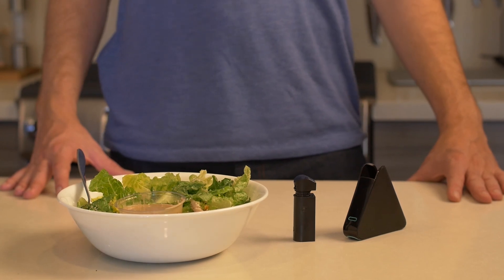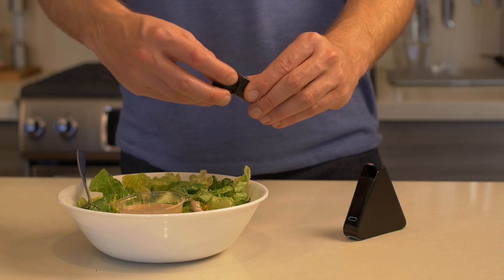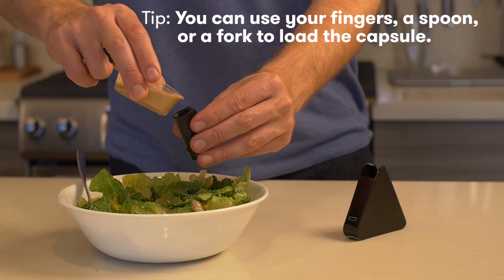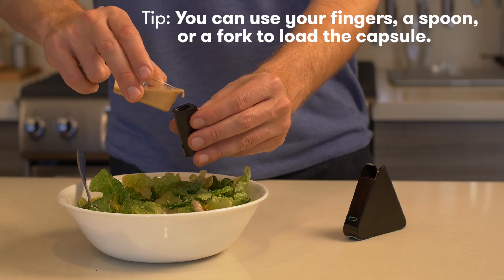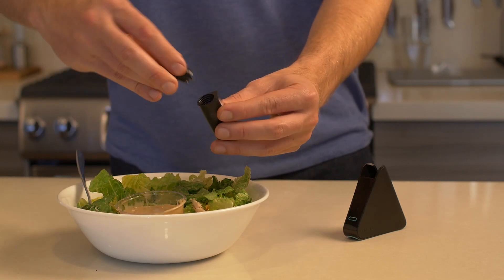Let's say I ordered the salad at a restaurant. I've already talked to the wait staff about my gluten-free needs, but I'm always worried about gluten being in the salad dressing. I'm going to take a small sample of this. Sometimes it's easier with your fingers, but you can also use a fork or another utensil that you have.